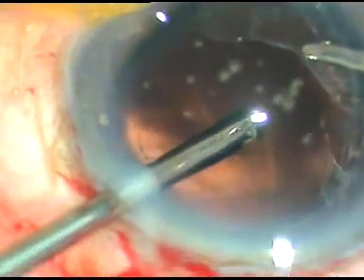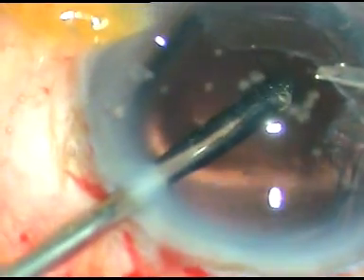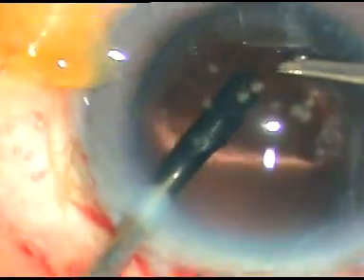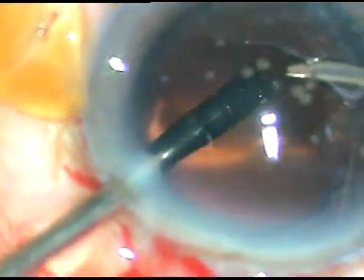And now another thing which is not usually recommended, I am doing that, doing vitrectomy through the limbal incisions.